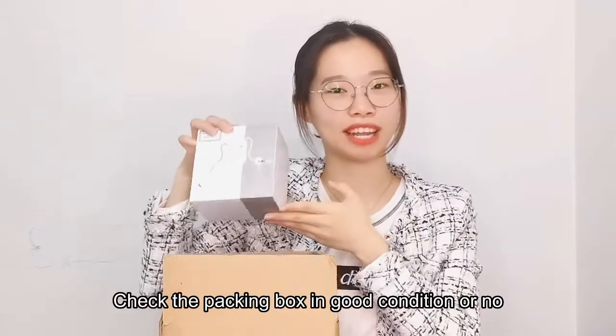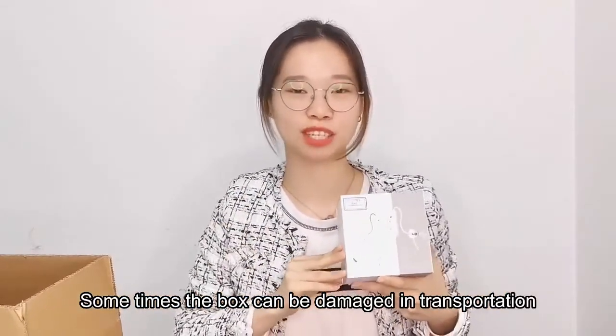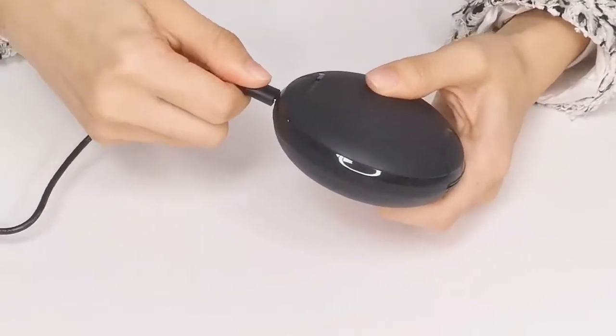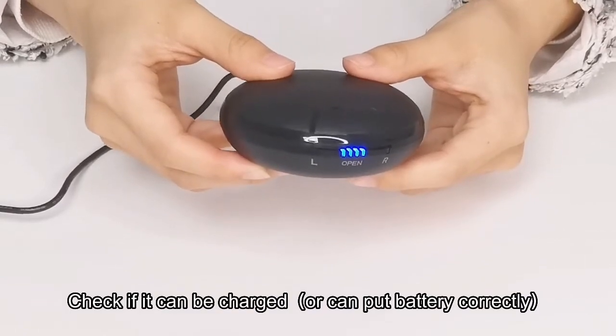First, check the packing box to see if it is in good condition. Sometimes the packing box can be damaged in transportation. Second, check if it can be charged or if the battery can be inserted correctly.